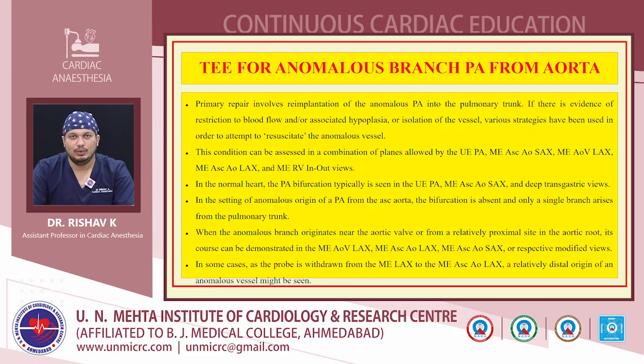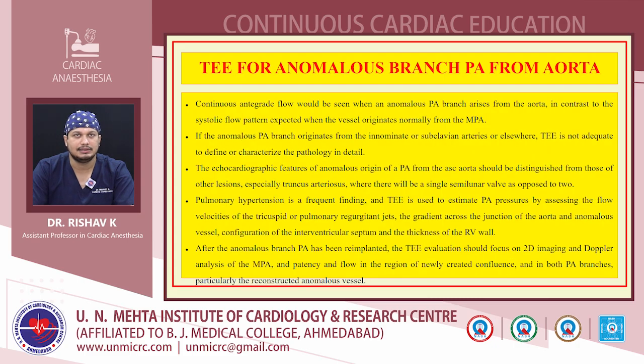When the anomalous branch originates near the aortic valve or from a relatively proximal site in the aortic root, its course can be demonstrated in the mid-esophageal aortic valve long axis views, ascending aortic long axis view, ascending aortic short axis view, or respective modified views. In some cases, the probe can be withdrawn from the mid-esophageal long axis view to the mid-esophageal ascending aortic long axis view, and a distal origin of an anomalous vessel can be seen in these cases.